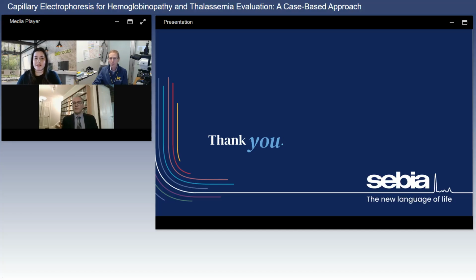This question asks, on the A1C assay, why does HGBF greater than 23% interfere with the A1C result? Okay, I believe I can speak to that one in particular because this is very specific to the capillary hemoglobin A1C assay, which of course is related to but is not the same thing as our hemoglobinopathy screening assay.